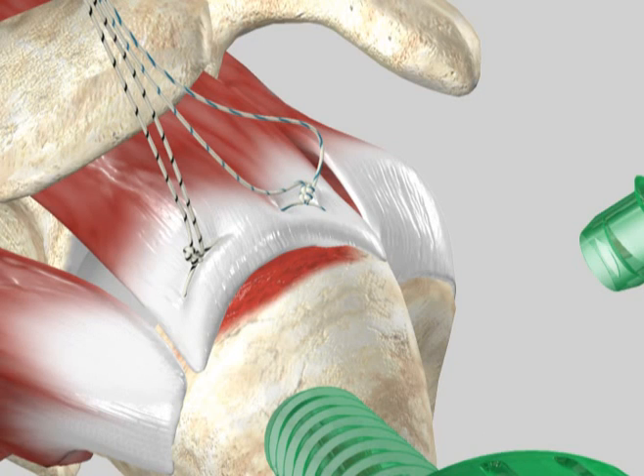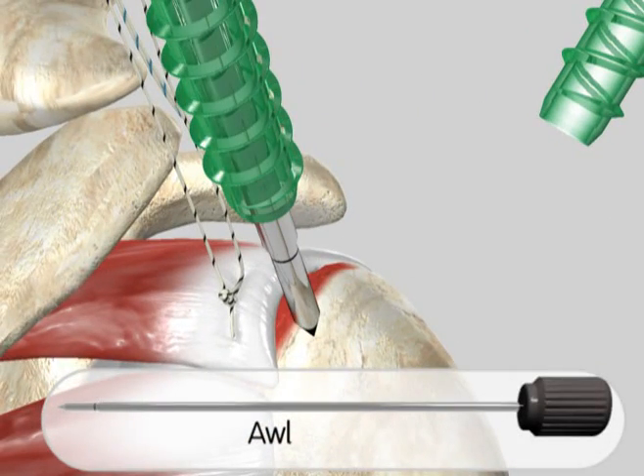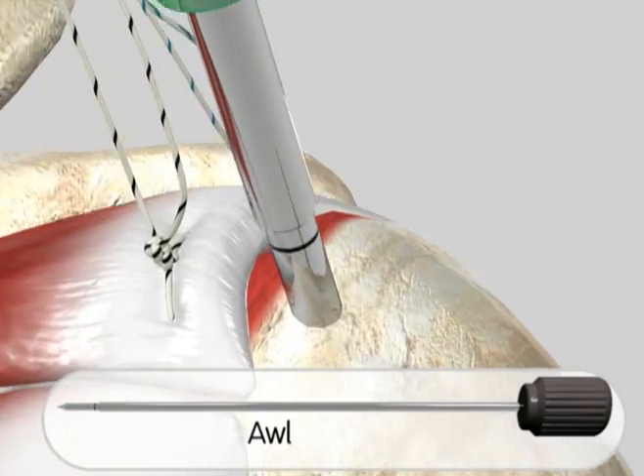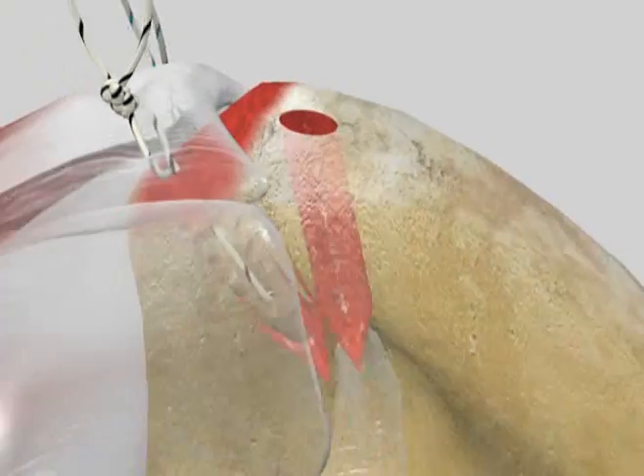It is important to always maintain axial alignment. Insert the awl down into the cannula, placing it at a lateral position on the edge of the footprint area. If the bone quality appears poor, the hole and anchor position can be moved to a more lateral position relative to the footprint edge. Tap the awl with a mallet until the etch mark on the inserter shaft sits at the bone surface. Remove the awl from the shoulder.